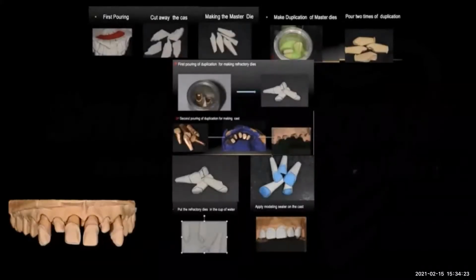One of the crucial aspects of successful aesthetic restorative dentistry is controlling gingival contours. Ideally, the ceramist should work on a master cast that has the gingival elements intact. As I mentioned in my previous lecture, aesthetic means health and beauty. Aesthetic score is divided into two sections: pink score and white score. Pink score defines the health of the gingiva.